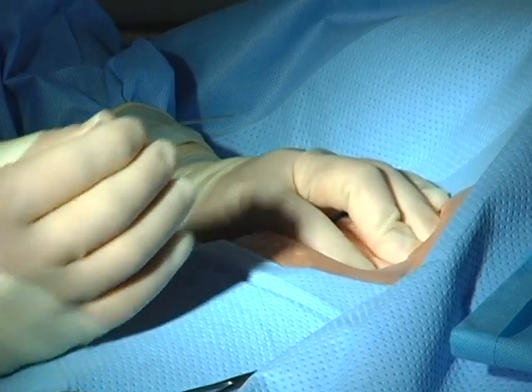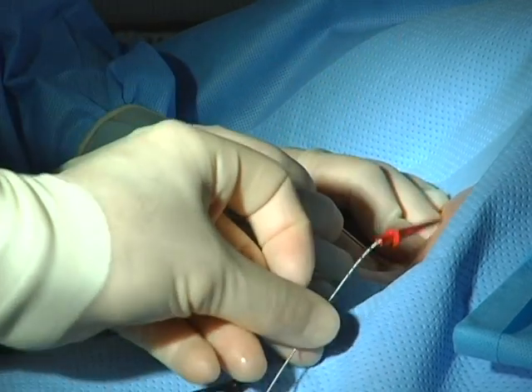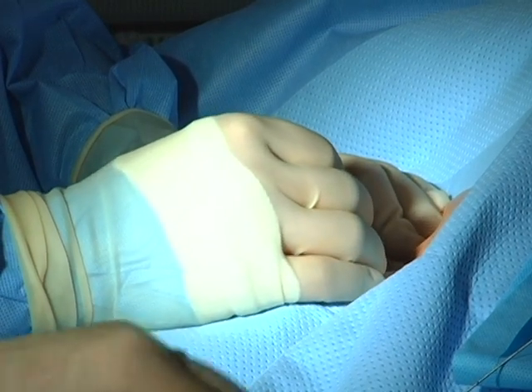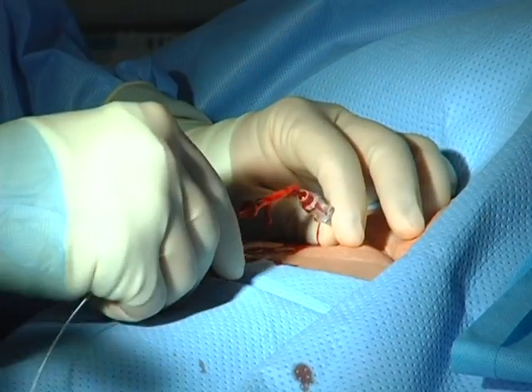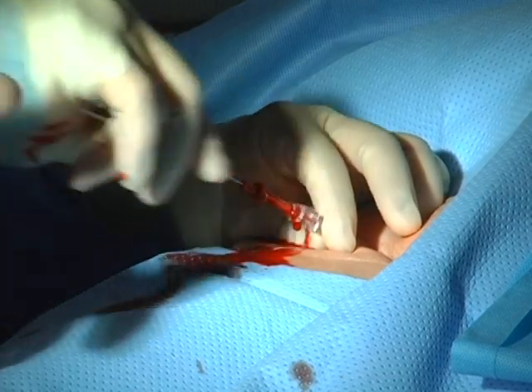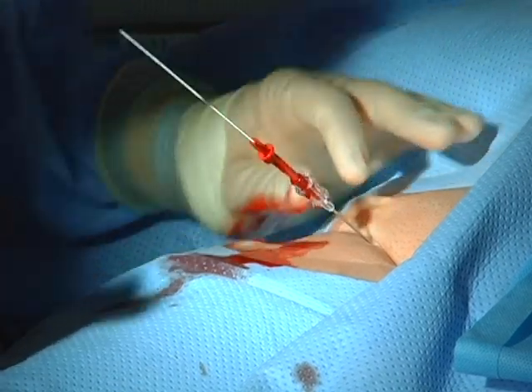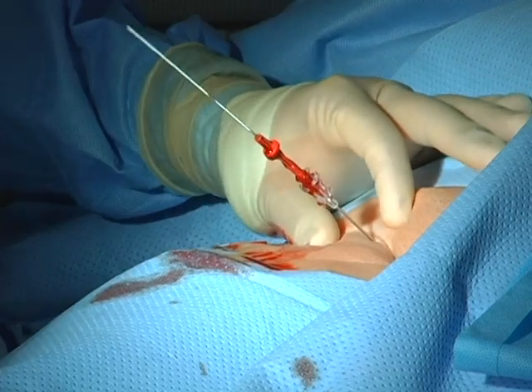And as the worthy assistant, I'm going to introduce the guide wire, or hand him the guide wire when it comes time. Okay, here's your wire. So we have access to the artery, and if you just keep your images here, go ahead. No, wait, before you go, let's make a little skin nick. This is customary if we want to think about a closure device at the end of our procedure, which we are thinking about right now.